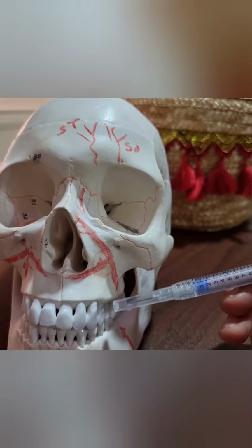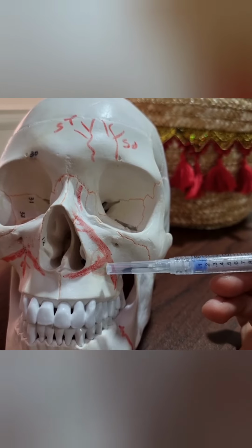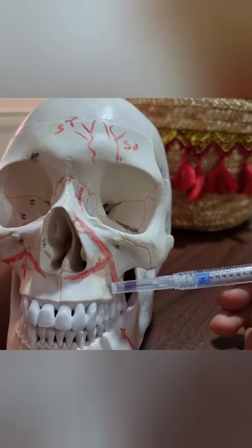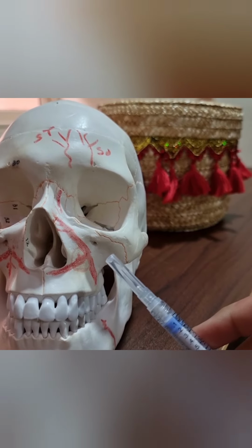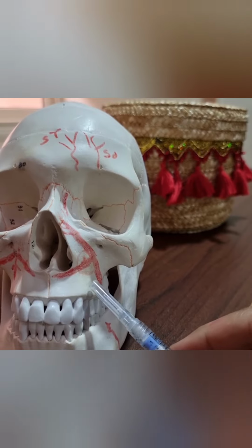When I inject the nasolabial, I must respect this course. That means when I go for the lower 2/3 I must inject subdermal or subcutaneous. إيه الفرق ما بين subdermal و subcutaneous؟ Subdermal, the angle of injection and also the amount of filler injected and the type of filler is very important.